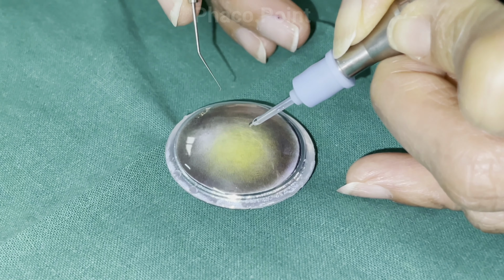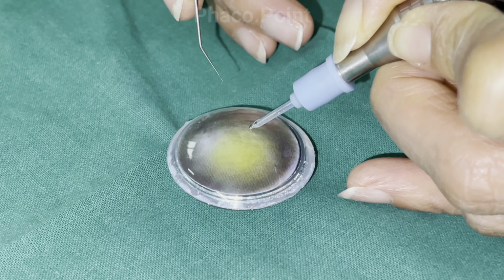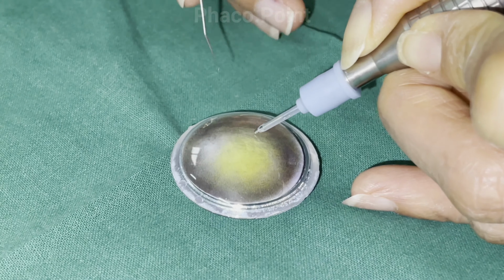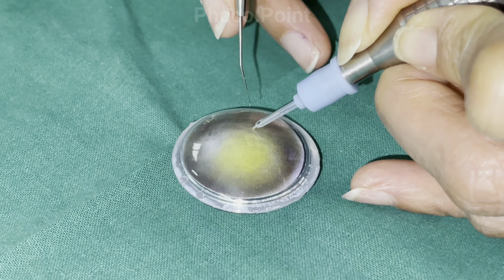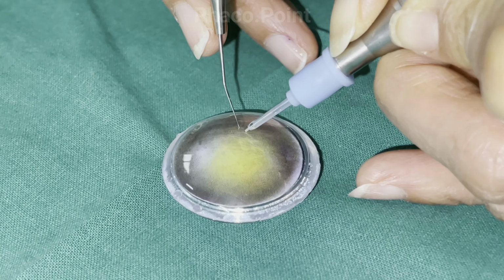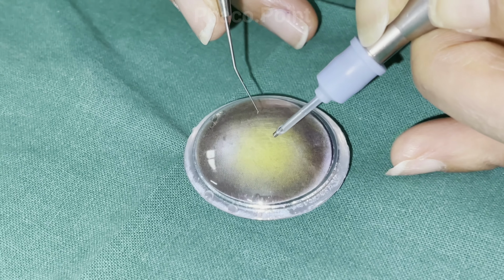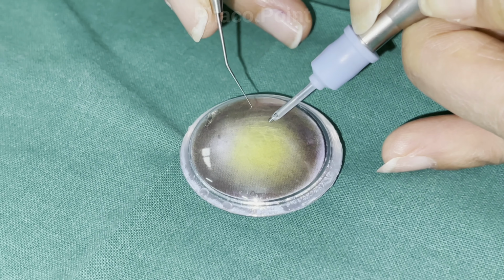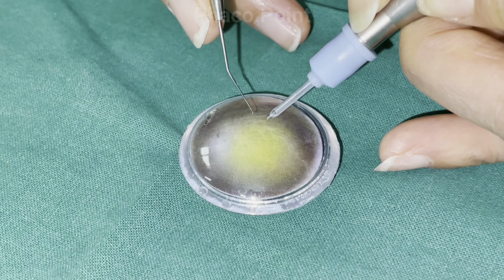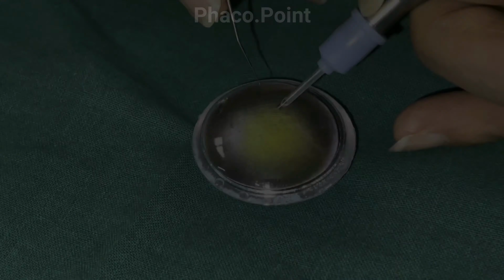Once you believe you've got to the desired depth, your foot pedal now moves to foot pedal 2 just to maintain that hold. And whilst maintaining that hold in foot pedal 2, the chopper now engages the nucleus distal to and lateral to the tip. And while still maintaining the foot pedal 2 itself, both instruments are moved apart to create a mechanical lateral separation and a fracture crack in the nucleus. Once this is done, the nucleus is then turned around.